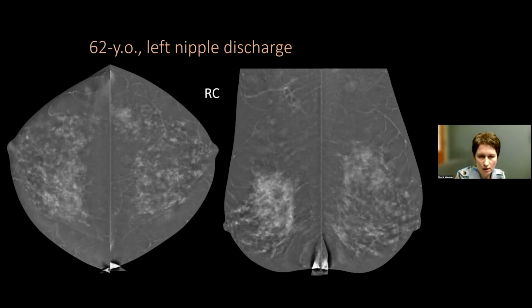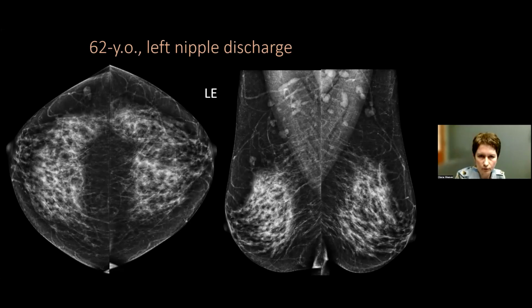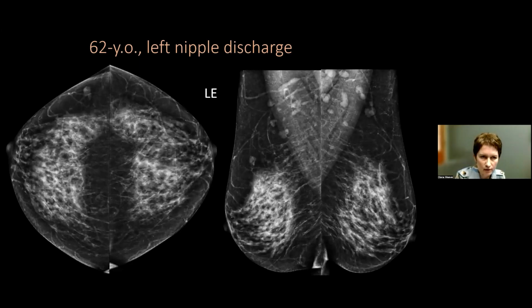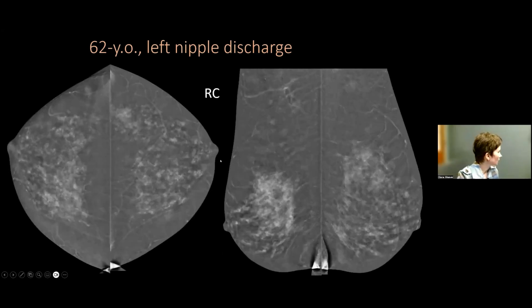And these are recombined images of contrast enhanced mammography. So again, you can go back and forth, and you can see how the anatomy overlaps and how some morphologic findings might be matching the recombined imaging findings. For example, this little mass of lymph nodes, you can see that there is an enhancement right there.